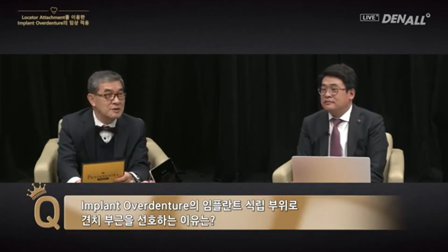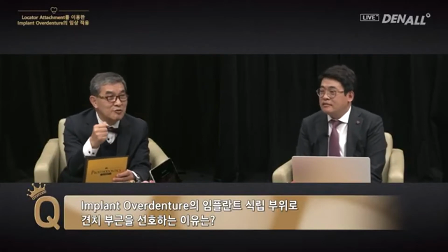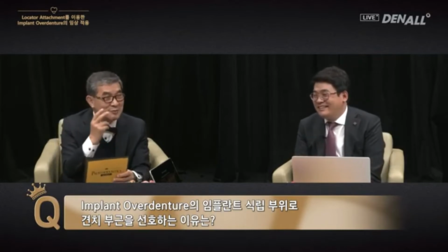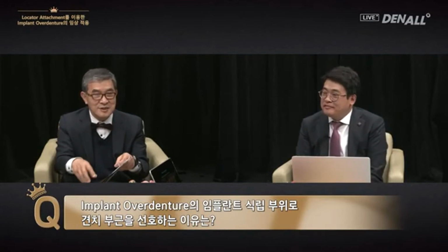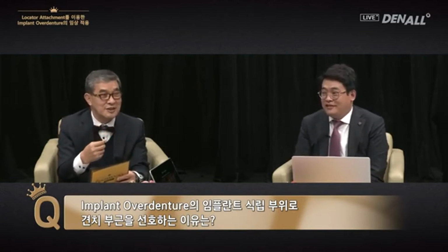Canine, yes, has a longer root. However, we came to the conclusion that canine had better bone quality. Canine is in the corner, and because it's under a lot of force, it became naturally stronger. That was the conclusion. You need to place in the canine to be able to put the clips on the bar type. I'm sure bar type is going to be addressed by another lecturer, and that is why I believe a lot of dentists prefer the canine. Thank you for asking your question.